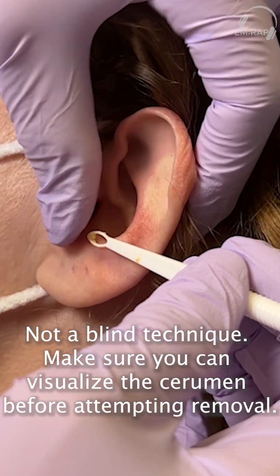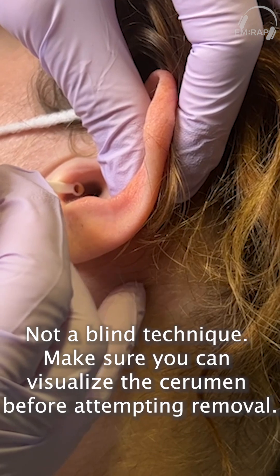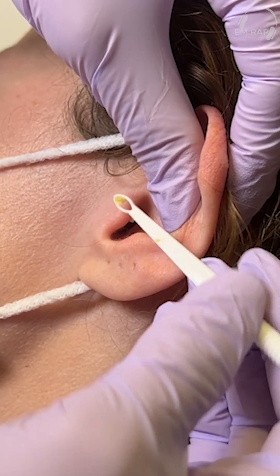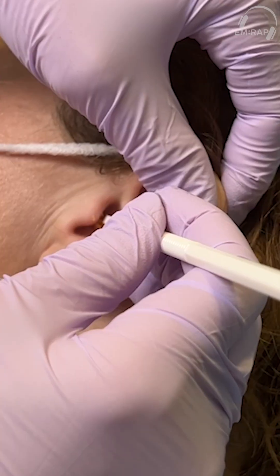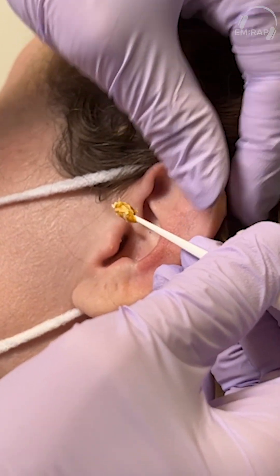Gently pull the pinna posteriorly and superiorly to straighten out the cartilaginous portion of the ear canal. Introduce the curette along the posterior wall of the ear canal and advance it. Initially I just got a small amount out, but on a repeat attempt I hook the wax and the cerumen is successfully removed.